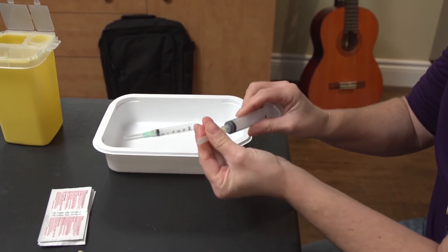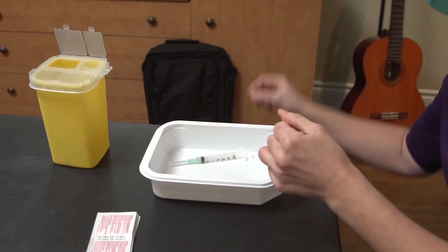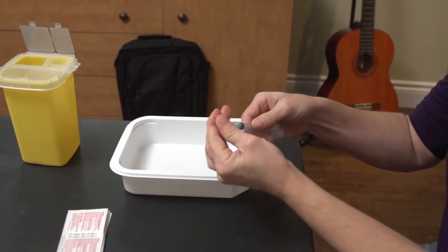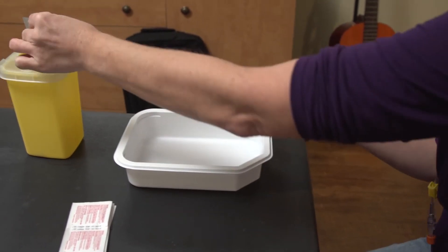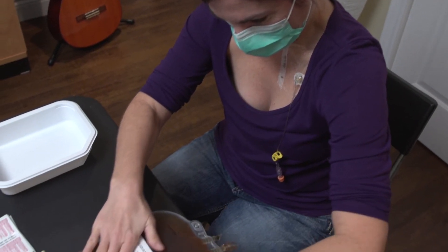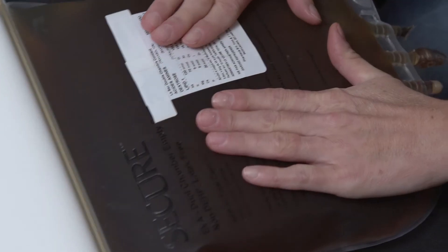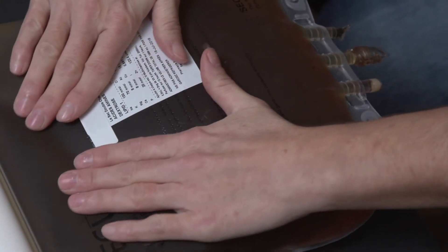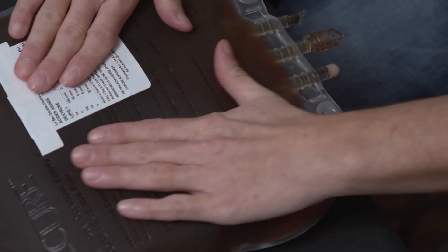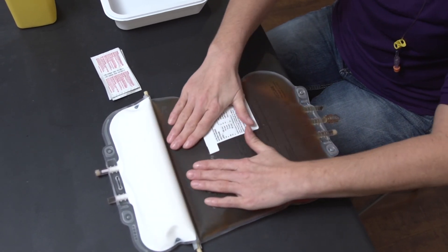Unscrew the needles from your syringes and dispose of the needles in the biohazard container. Discard the syringes in the wastebasket. Gently press the bag to make sure it isn't perforated. If you notice that the bag is perforated, do not use it. You must take a new solution bag from the refrigerator, leave it for at least an hour outside the refrigerator before using it, and repeat every single step.